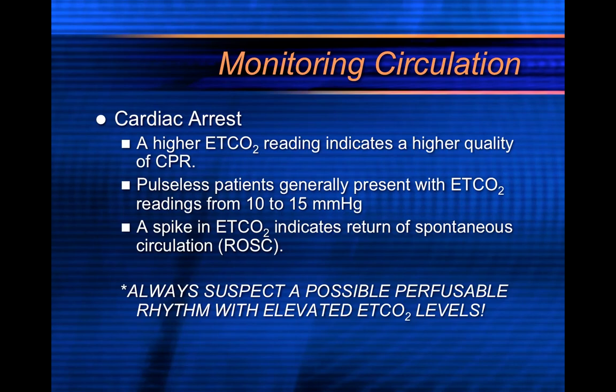Yes, of course. Get a capnography value, and as you're doing CPR on these patients, for instance, let's say they have an initial value of about 10, and they're in cardiac arrest. That's a low value. They definitely are in cardiac arrest if they've got a value of 10. So you get that value, you start doing CPR, and you notice the values start coming up, 15, maybe 20, maybe 25. You see values like that, you know you're doing good CPR. In fact, if you get values that start going up, it's a good indicator that this is a viable patient, that this patient can survive if you get a pulse back.